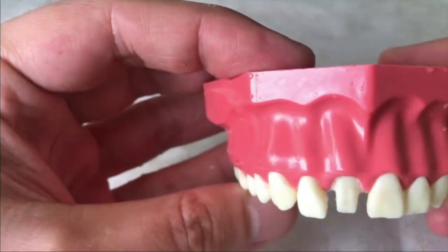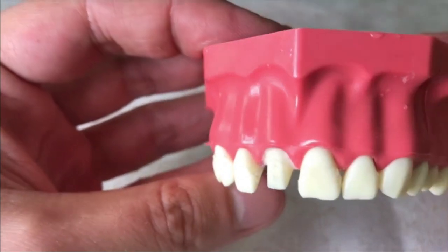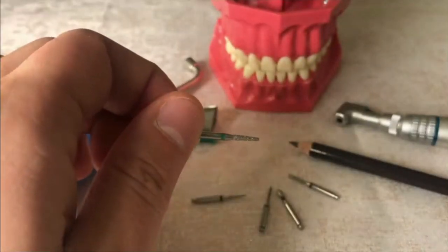Hey everybody, today I will demonstrate maxillary anterior tooth preparation. Here you see the 5 burrs that we will use on the preparation.